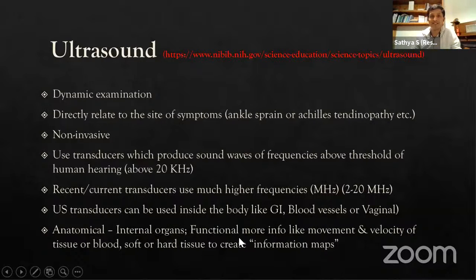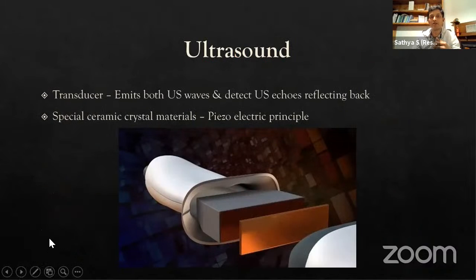We know the major function we use for pregnant women is to understand how the baby is moving, and you are able to see a moving structure, a baby, and understand what is happening, creating information maps based on what you're seeing internally. For example, liver, kidneys, kidney stones, gallstones, gallbladder, pancreas, and spleen sometimes. And with bladder dysfunctions, you are able to teach people. So ultrasound plays a major role in all these.